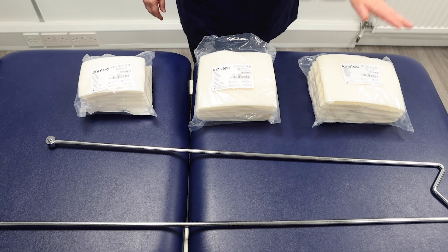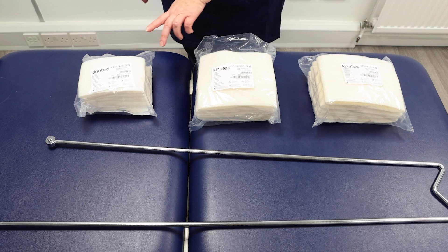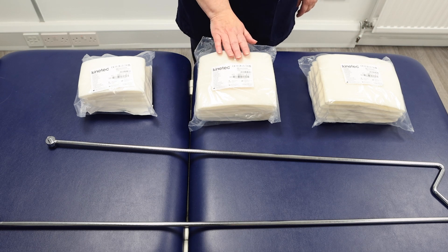Select the splint sling. These are available in large, medium, and small. In this case, we are using a medium size.